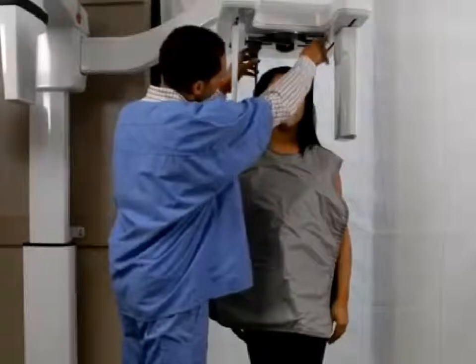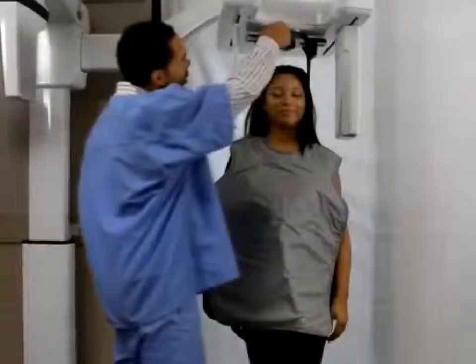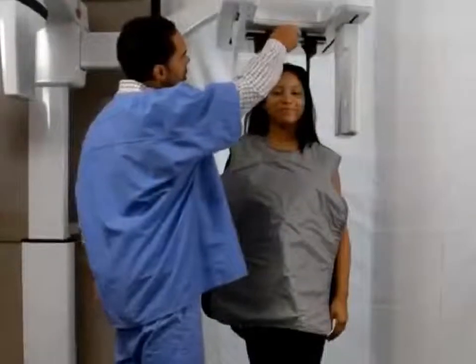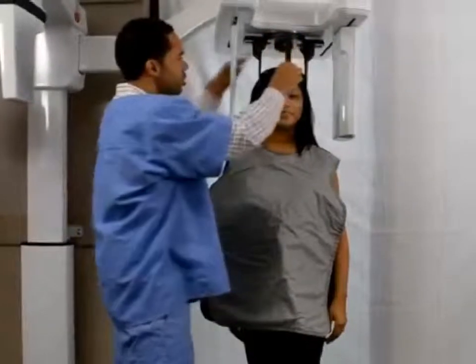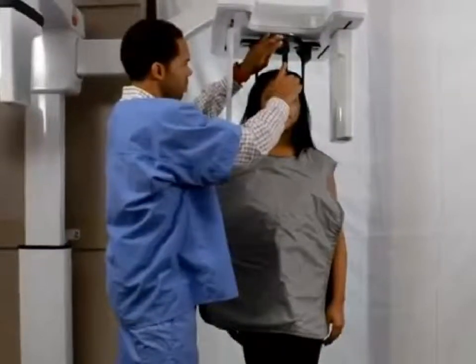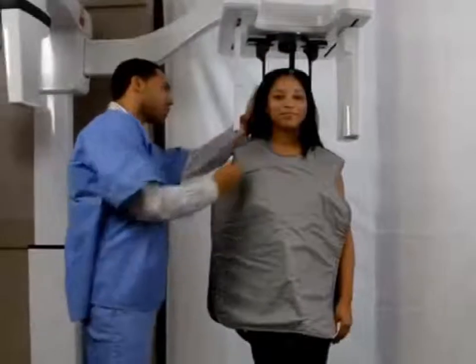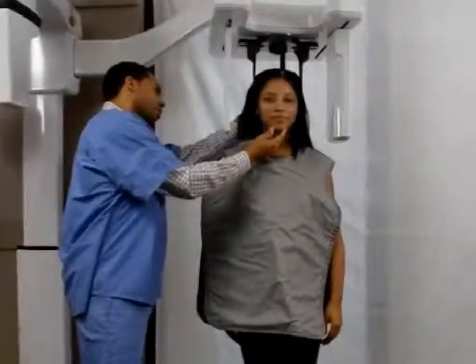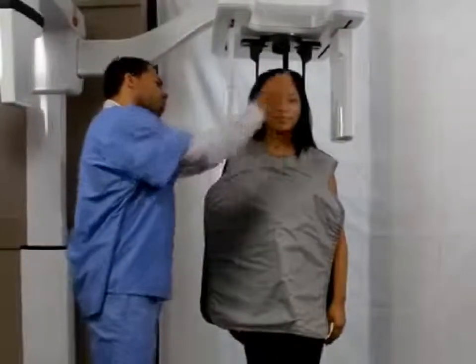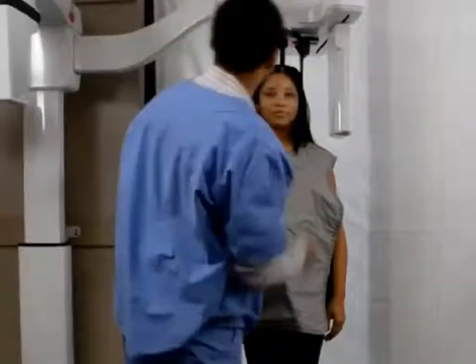Slowly close the head clamps to stabilize the patient's head. Lower the nasion support to a vertical position and align the patient's head on the Frankfurt plane. If needed, you can use the Frankfurt Positioning Indicator as a visual aid to adjust the up or down inclination of the patient's head for a Frankfurt plane horizontal alignment. Check that the nasion support is well placed.